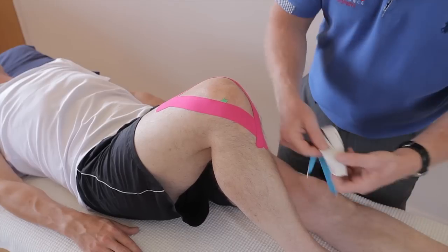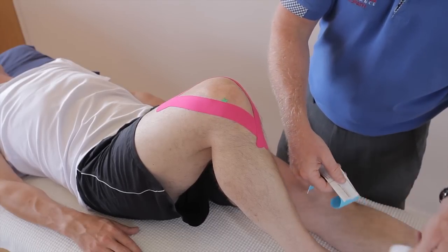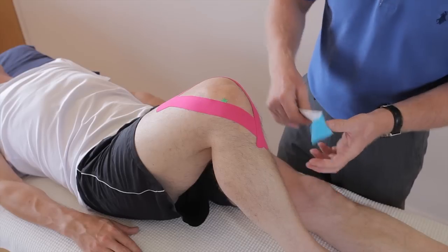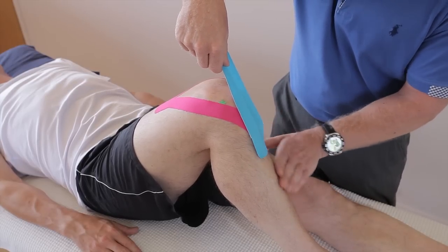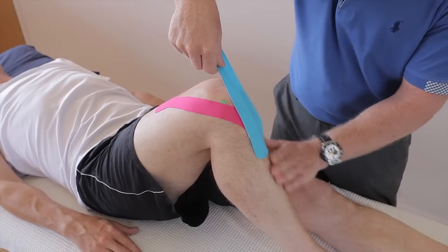For the second tape, peel back and split the two legs again. This one is going to be inferior to the tibial tuberosity. Stick that down — remember, no stretch on the ends of the tape.